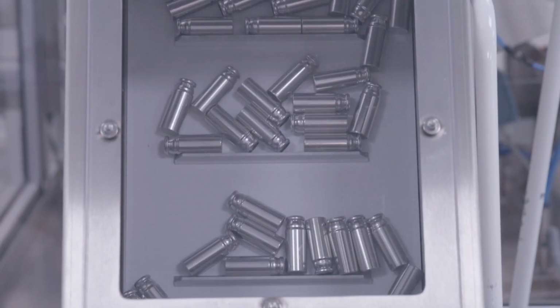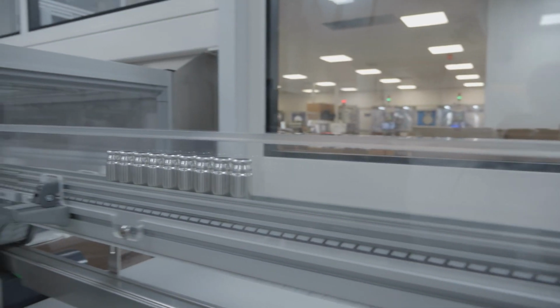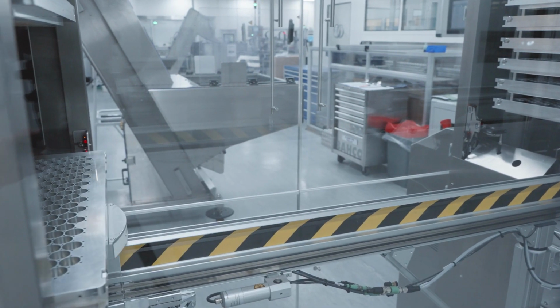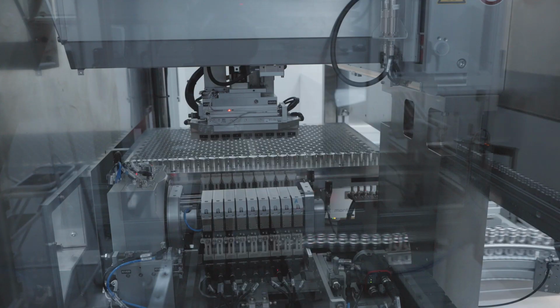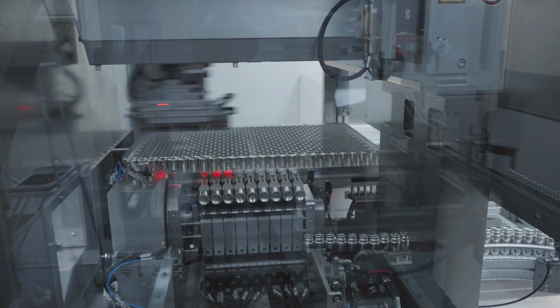Once our MDI cans have been pressed and cleaned, they are placed into a bowl feeder at the start of the plasma manufacturing process. The cans are then fed along a conveyor belt into the jig placing machine. The cans are then automatically placed into the jig until it is full. One jig holds 600 cans.